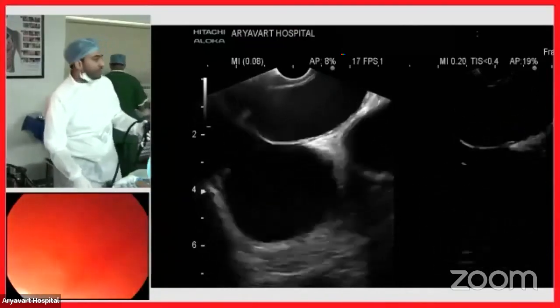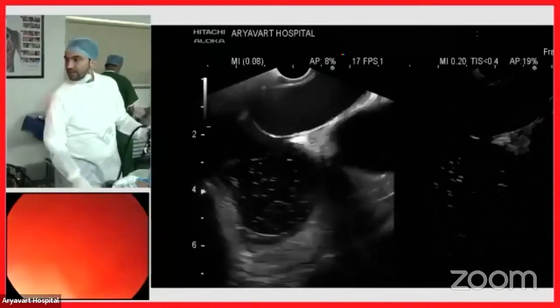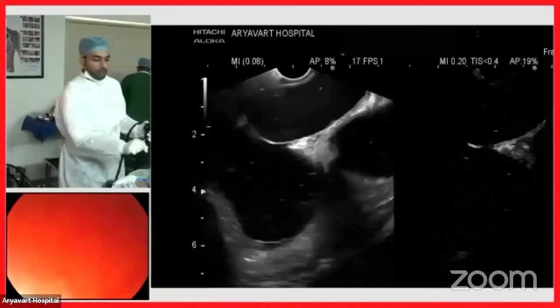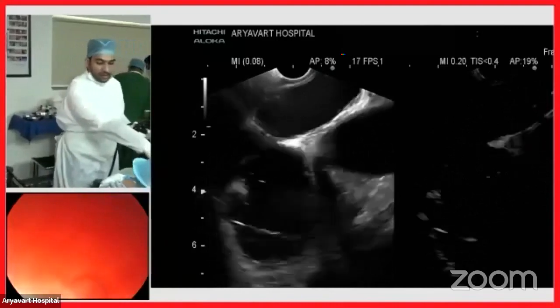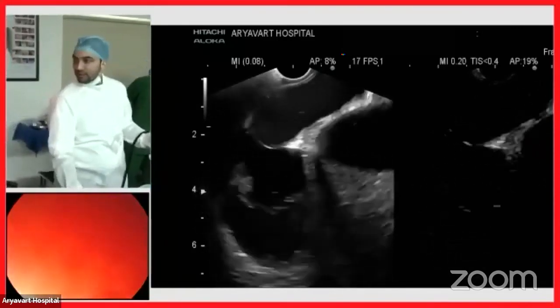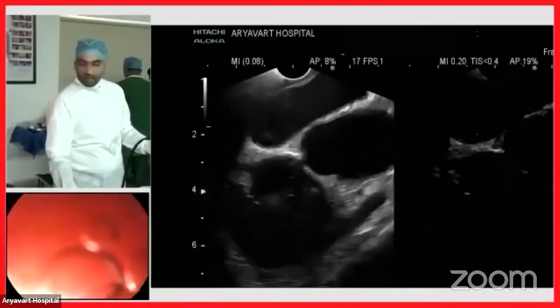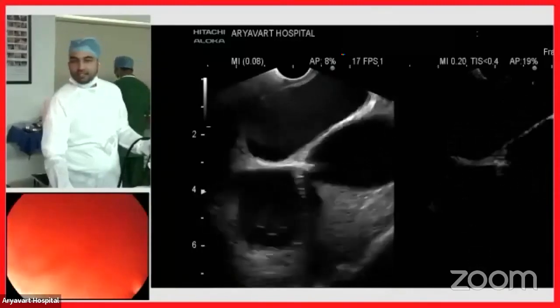So I think we went a little fast. So I'm just going to demonstrate that again. We'll let the bubbles clear out. So we are using a proximally placed cannula. It's a wide bore cannula, at least 18 gauge, placed in the antecubital vein. It is not a peripheral cannula. We're using a closer placed cannula because we want the contrast to go straight in. 10 ml of bubble agitated saline is usually good enough.